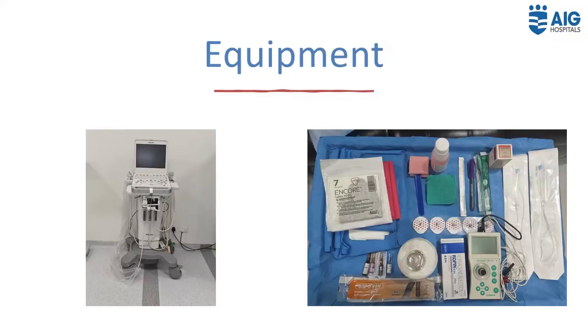After obtaining patient consent, attaching monitors and confirming the site and side of the procedure, one should make sure all required equipment is at hand, namely a USG machine with sterile probe cover, sterile drapes and gloves, antiseptic solution for sterilizing the block surface, sterile scale and marker, local anesthetic and a 5 cc syringe and 1.5 inch 25 gauge needle for skin infiltration, PNS and ECG leads for earthing, 10 centimeter long short bevel insulated needles, local anesthetic for block, 20 cc syringes, emergency drugs, and intralipid emulsion.